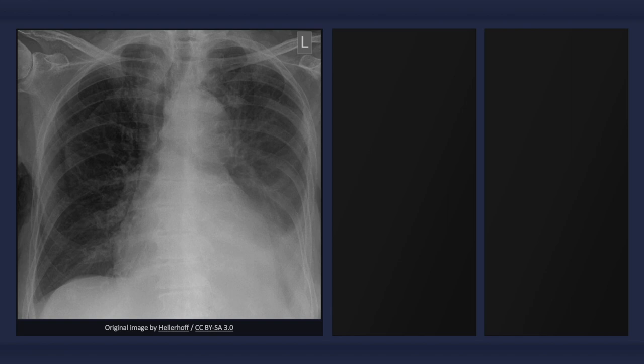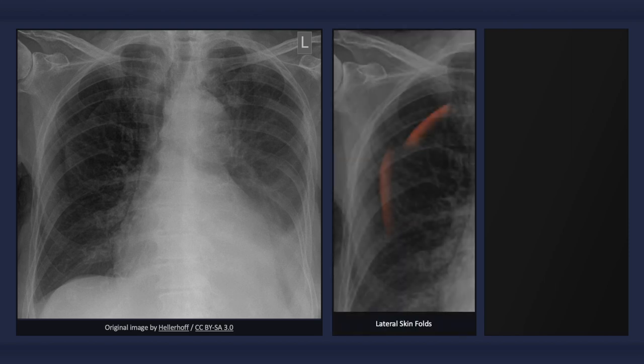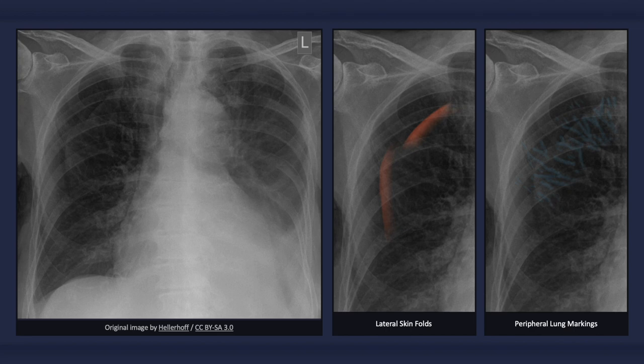A skinfold on the chest can result in an abrupt drop-off in opacity, thereby mimicking the radiographic findings of a pneumothorax. A skinfold, however, has a dark band — as opposed to a light one — at its lateral contour. In the case of skinfolds, bronchovascular markings extend to the periphery of the lung, whereas with a pneumothorax they do not. Keep in mind, however, that apical bronchovascular markings may be difficult to appreciate.